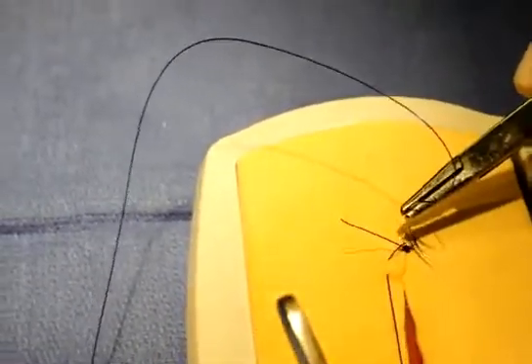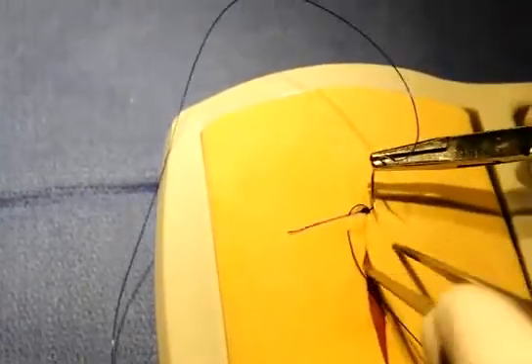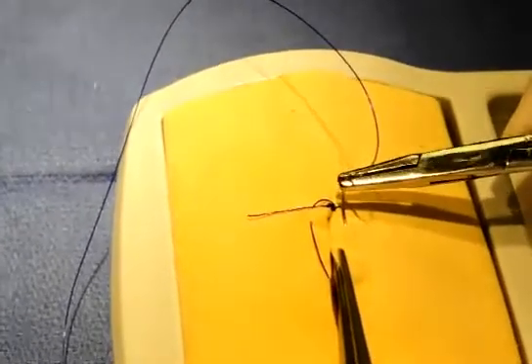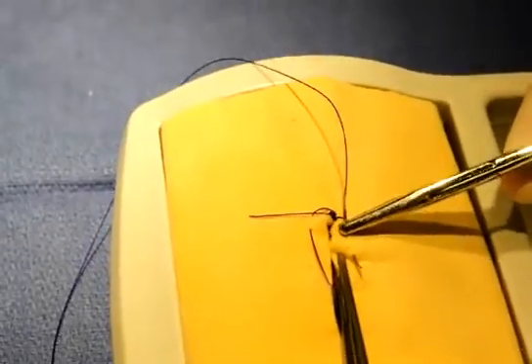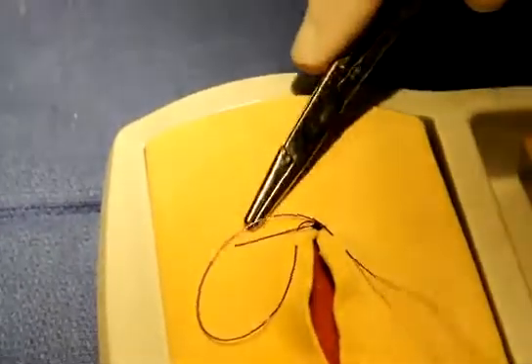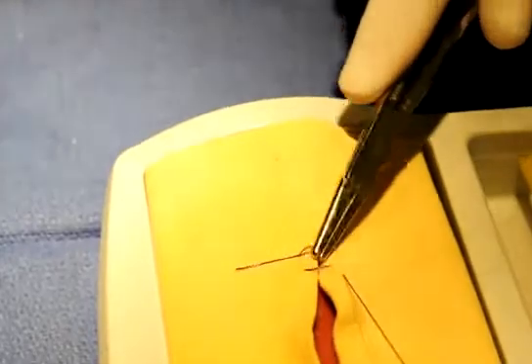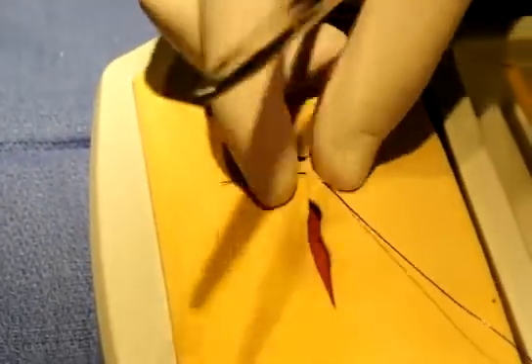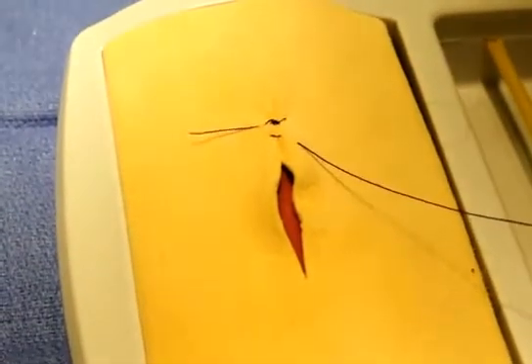There we go. Okay. Then the next one is going to go in roughly across from where that first one came out. Again, not penetrating into the mucosa. So a partial thickness. It's supposed to grab the submucosa though. Remember, that's the holding layer. Okay. And when we pull these tight, you see how that's rolling up and pinching up. It's making the edges go down in, inverting.